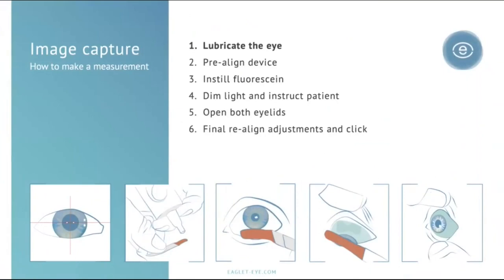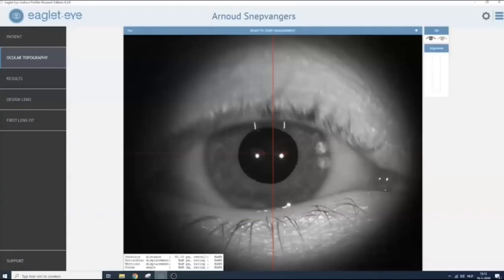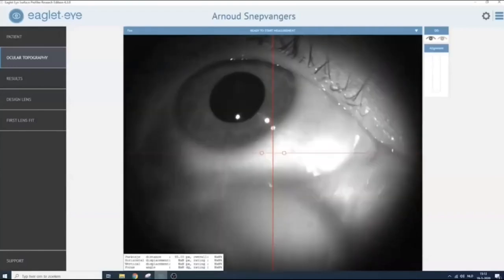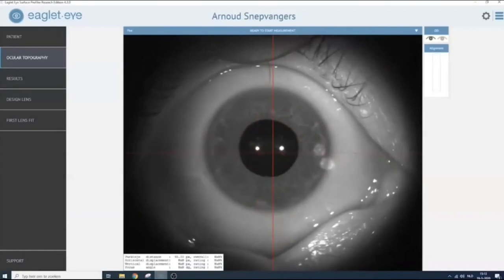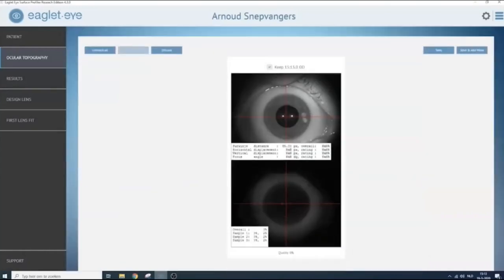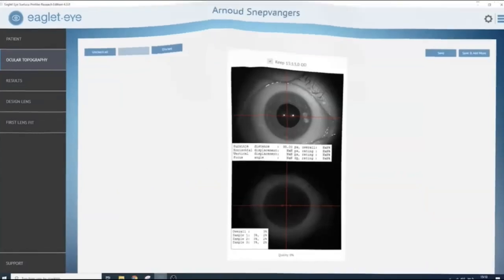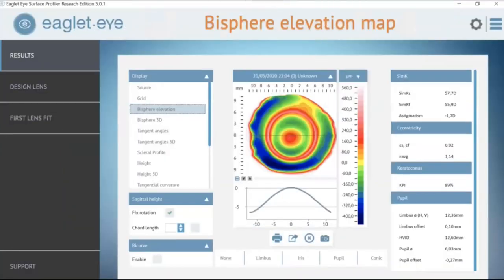The image capture is easy. We lubricate the eye, pre-align the device on the patient, instill fluorescein, dim the lights, and instruct the patient to look straight ahead. We open both eyelids, do a final check of alignment, and just click. This is what the technician sees: open the eyelids, direct the patient to look straight ahead in primary gaze, align the Purkinje images, and confirm a good capture area. This gives us the bisphere elevation map.